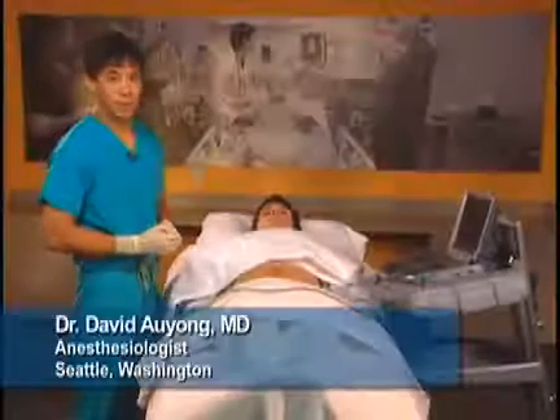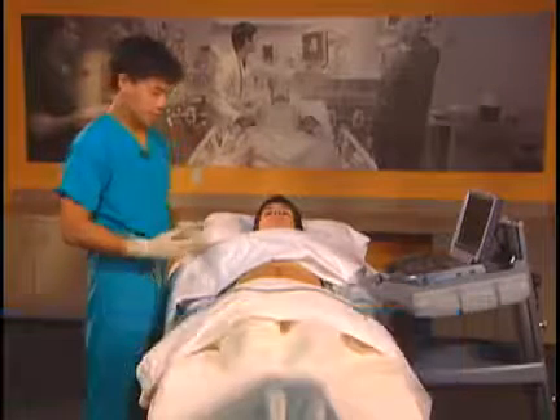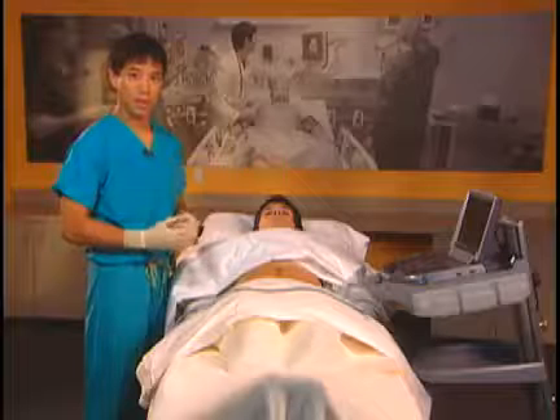The ilio-inguinal ilio-hypogastric nerve block is used for inguinal hernia repair and lower abdominal surgery. This block is a field block where we put the local anesthetic within the plane between the transversus abdominis and the internal oblique muscle.